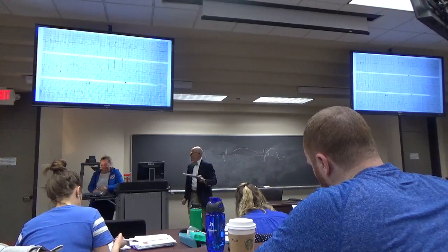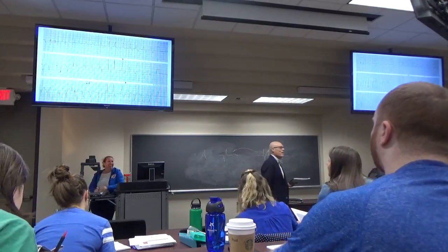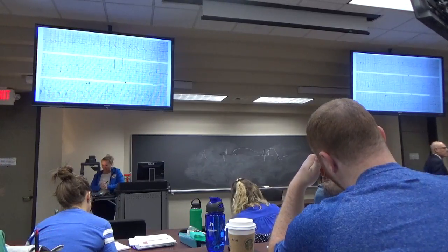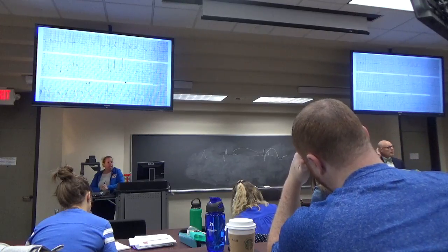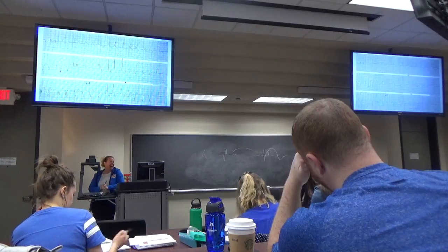It's a volcano. I call those volcanoes. Okay, so it doesn't look like the traditional right bundle branch block. Why is that? Because what? Everybody's different. No, that's not why.